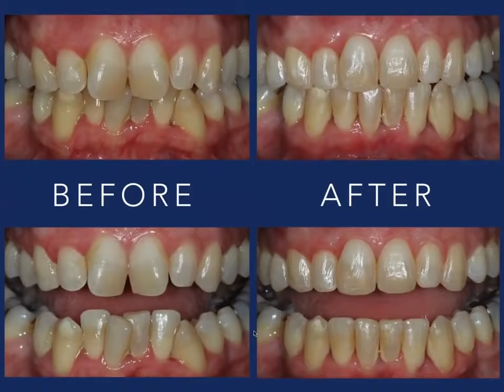Even that lower left canine, number 22, is pretty severely out of alignment there. So we used Propel and VPro 5 on this patient, and our total time in treatment was just over a year. She opted to change trays out at 5 days, and we thought that was a better solution for how many rotations we needed here. And so that was the result we got in just over a year.